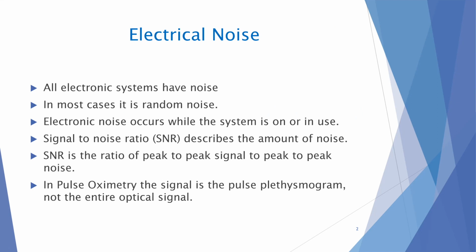So I think one of my biggest concerns about the physicians that use the electronic stuff that we build for them is that they believe the numbers. And I just want to explain that comment a little bit, which is all electronic systems have a noise floor. They all have noise. And in most cases, it's purely random noise. And the noise is fixed, and anytime the system is working, it's there.